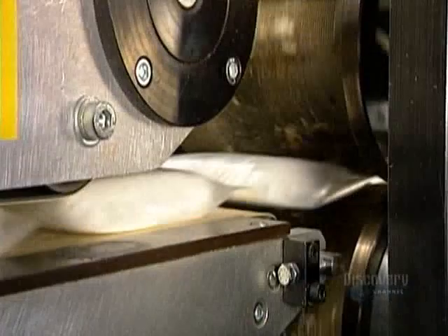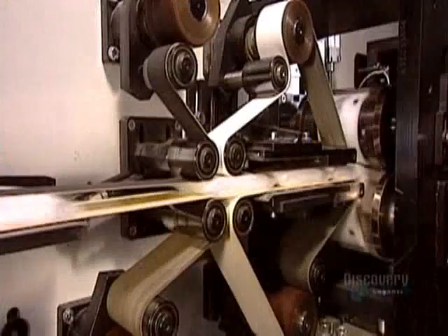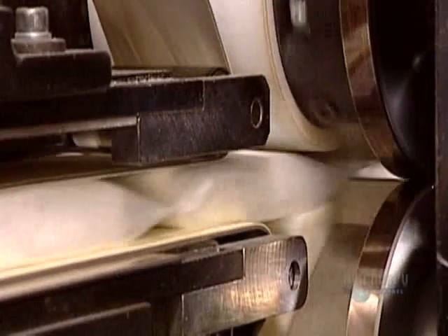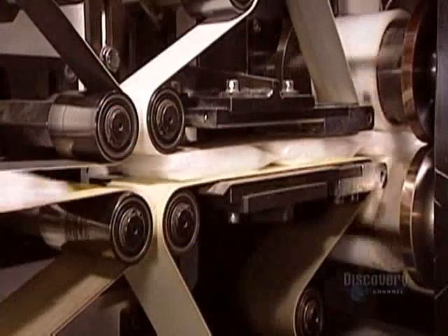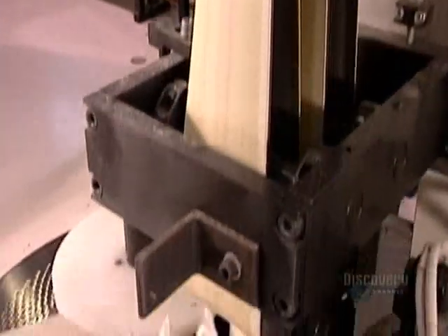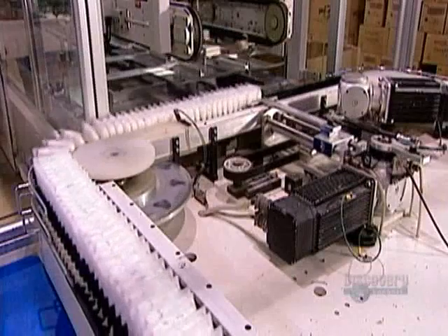A hot iron-like device called an embossing press seals the plastic around each pad. Then a knife cuts in between the pads, separating them into individual pouches. Next, 2 belts sandwich the pouches and carry them down to the stacker, where an automated counter lines them up for packaging.